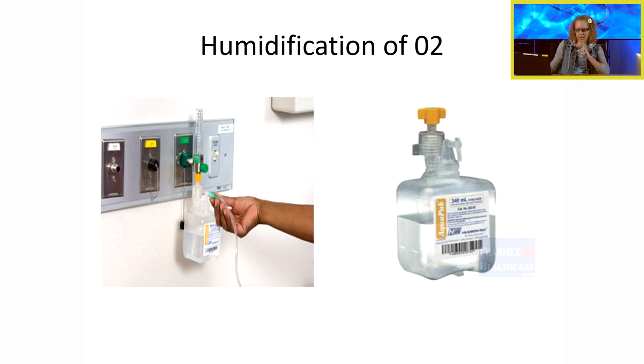We connect the humidification bottle, and then we connect our tubing to the humidification bottle, and then we connect that tubing to the patient so that as the oxygen is coming through the tubing, it is getting humidified.